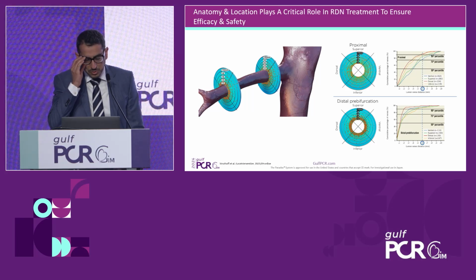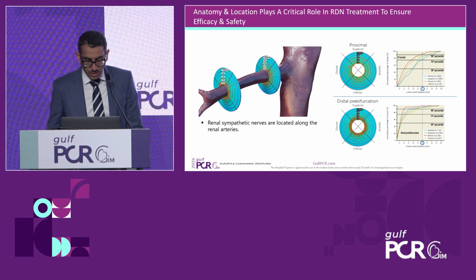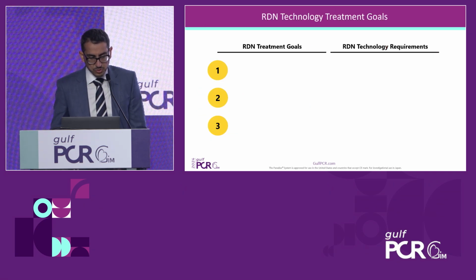All right, so to talk about a different method, really this is looking at renal denervation, but an ultrasound-based therapy. We'll just talk about the technology itself. As mentioned before, we won't belabor the slide, but essentially it shows the different points of where the renal nerves are and how they coalesce as you go more distal into the renal artery itself. What's interesting is that the majority of the renal nerves are within 6 millimeters depth of the vessel, and so this formulates the concept of the ultrasound technology.